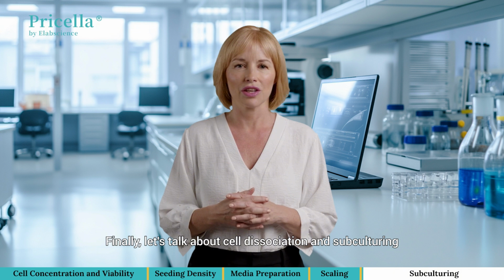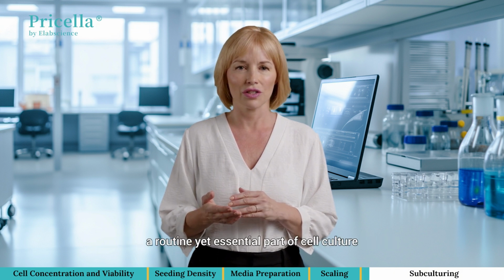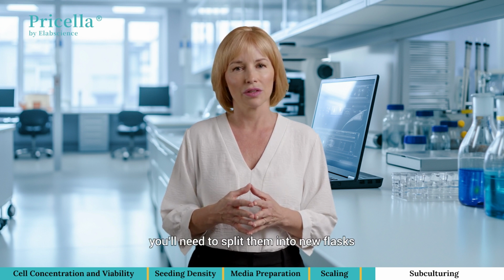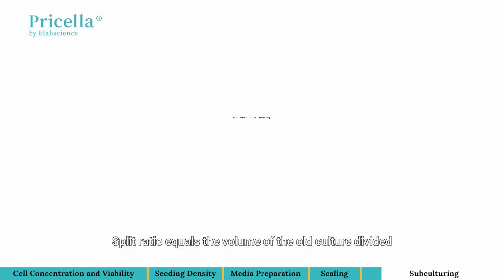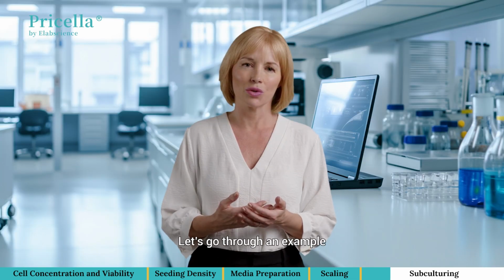Finally, let's talk about cell dissociation and subculturing, a routine yet essential part of cell culture. When your cells grow too crowded, you'll need to split them into new flasks. Here's a handy formula for split ratios. Split ratio equals the volume of the old culture divided by the total volume after splitting. Let's go through an example.